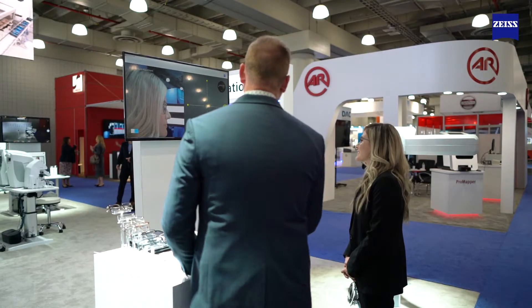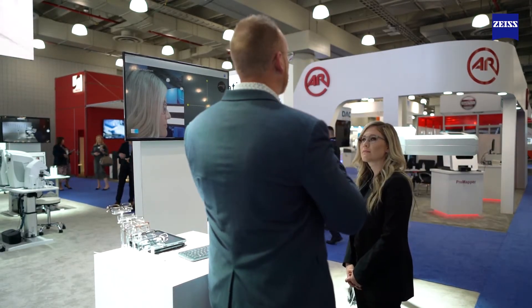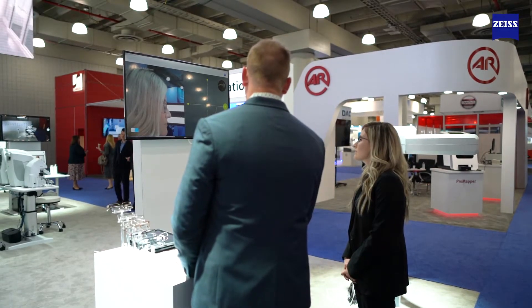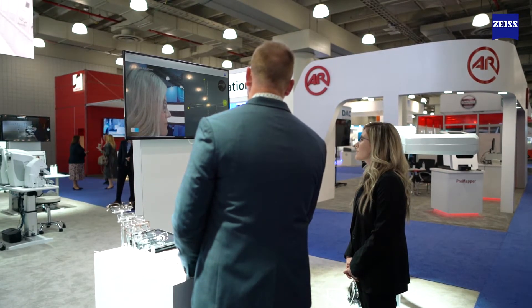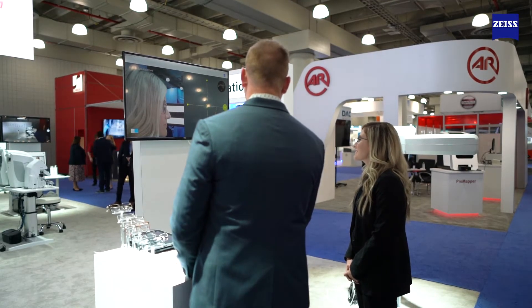I want to make sure you're looking straightforward, because as we know, as we lift our chin we can affect pantoscopic tilt. You're looking in the correct gaze, but if needed we could adjust your head tilt upwards or downwards in case you were raising your chin or lowering it.